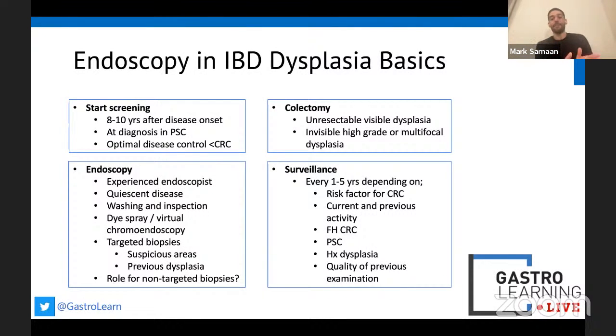I was going to say you need 3 points to do these procedures properly. With dye spray, you definitely did, because you ended up doing 2 colonoscopies almost. I still think we should be booking these as 3-point procedures, even though we're potentially not going to be dye spraying in the future, because this is all about time and washing and having a very good close look, taking away areas that you think might be a little bit iffy.